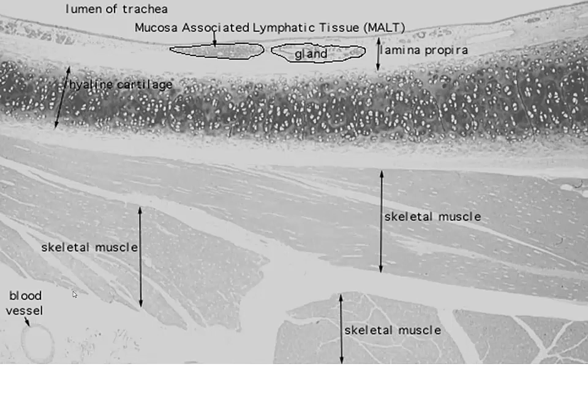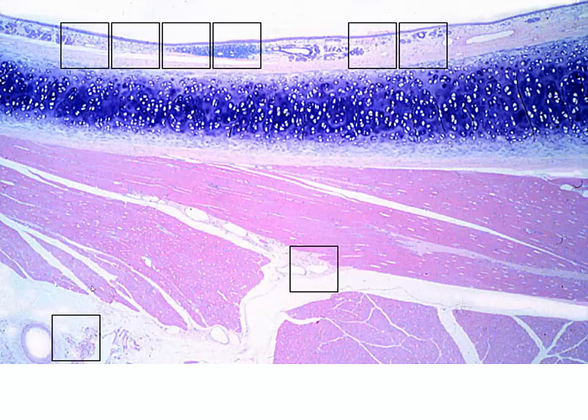Certainly, our cartilage is going to be a form of specialized connective tissue. And in our lamina propria, we're either going to have the dense irregular connective tissue, or sometimes in our lamina propria, we might actually see loose or areolar connective tissue, depending on how many spaces and how many cells we might have in a particular section. This looks to be dense irregular in this particular slide.